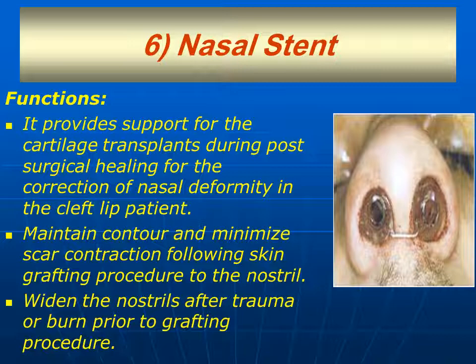In addition, it can be used to widen the nostrils after trauma or burn prior to grafting procedures. So I can use it to widen the nostrils opening prior to grafting procedures.